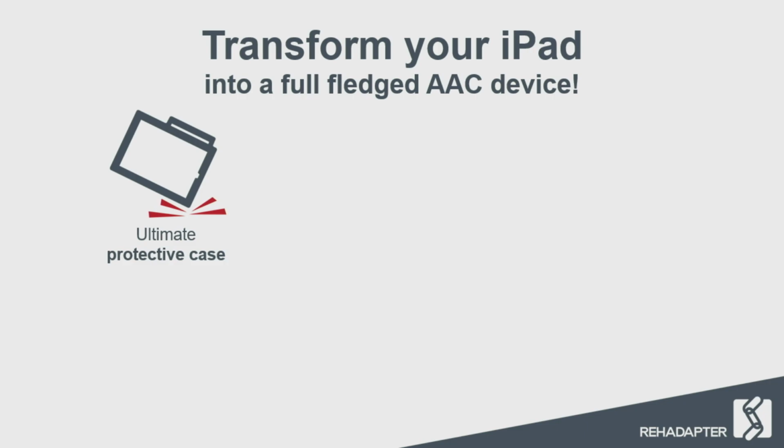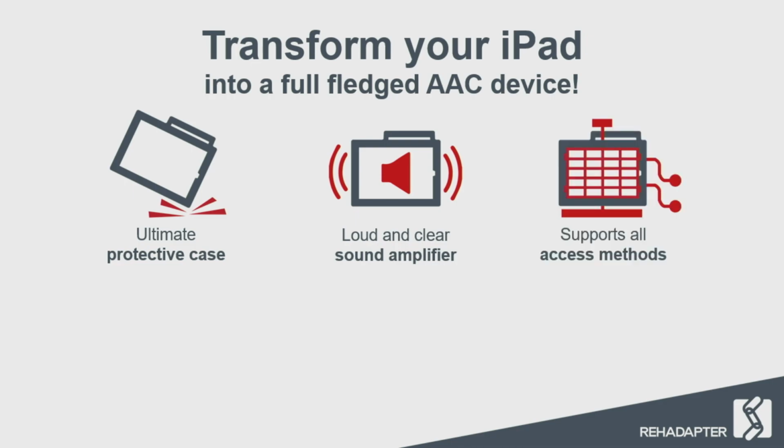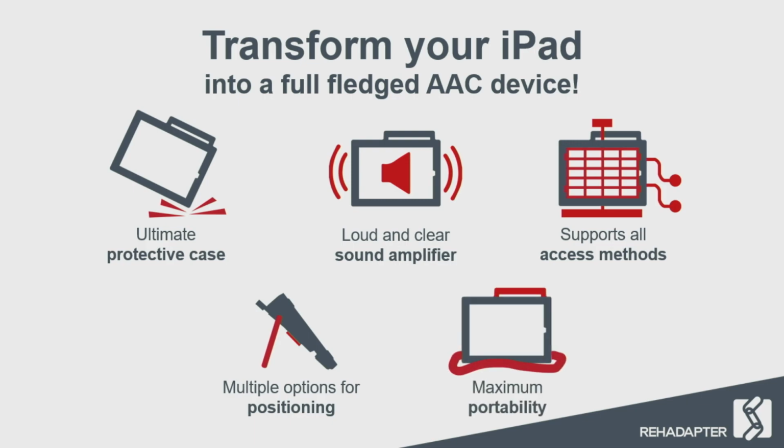So what we try to do is to provide the ultimate protective case that is available for the market. With an integrated and loud speaker amplifier that has a speech-optimized setup to be understood especially by the communication partners in the best possible way. We tried to find a solution with one case to support all current common access methods in the market. And we also have found several options to position the device as best as possible, and also portability options.